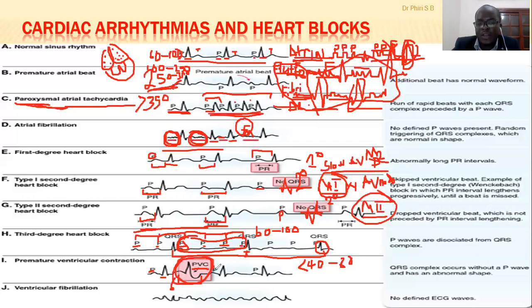And then you have a normal P wave, QRS complex, T wave, then another P, then maybe you can have another abnormal premature beat. Then down here you have ventricular fibrillation. So just like we had atrial fibrillation, the heartbeat has increased here to greater than 300 action potentials per minute, and these action potentials are getting to the ventricles.